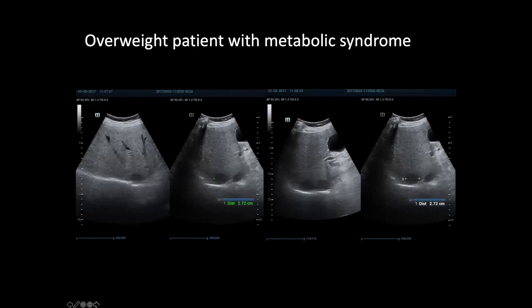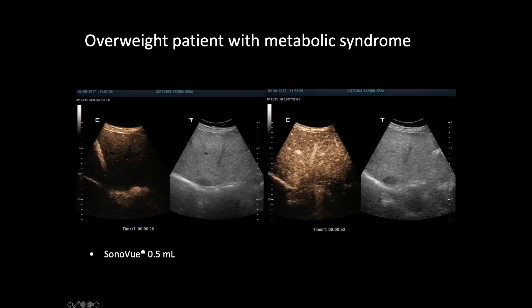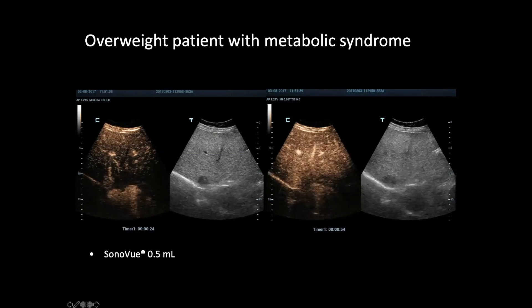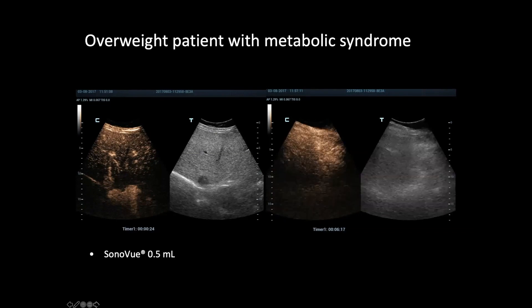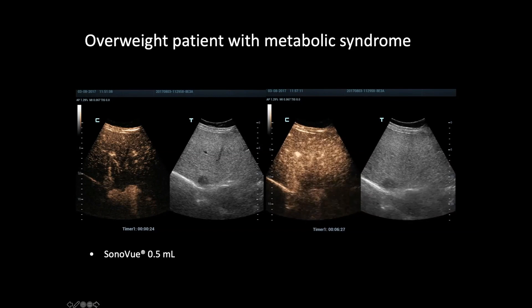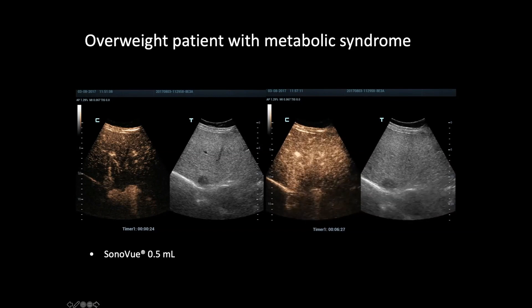Now we have an overweight patient with metabolic syndrome, with a lesion more than 10 centimeters deep in a steatotic patient — difficult to understand. With 0.5 milliliter injected, you can really see the replenishment from the periphery to the center of the lesion. After 5–6 minutes you still see the replenishment, even at more than 10 centimeters depth. So the reduced dose is quite enough to understand that this is an atypical hemangioma with typical CEUS behavior.